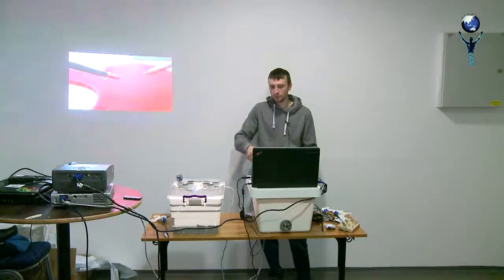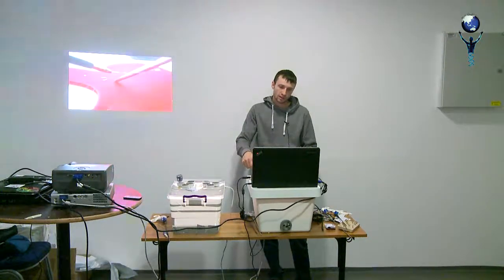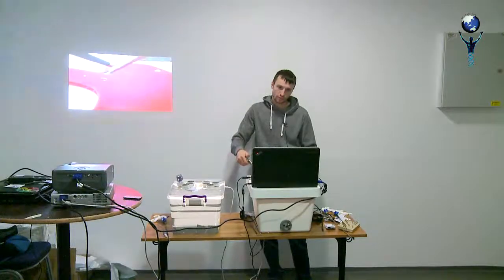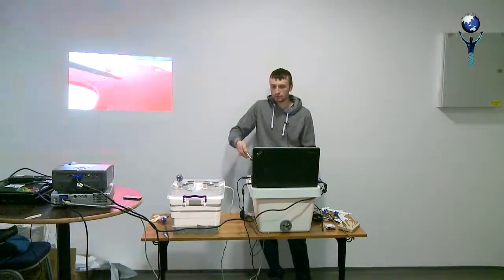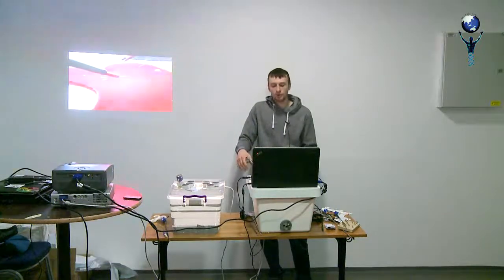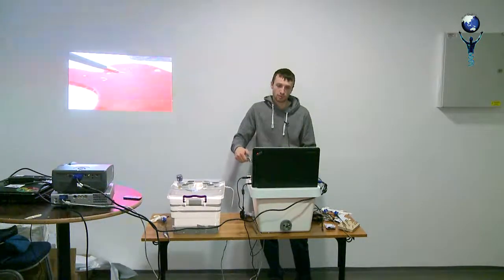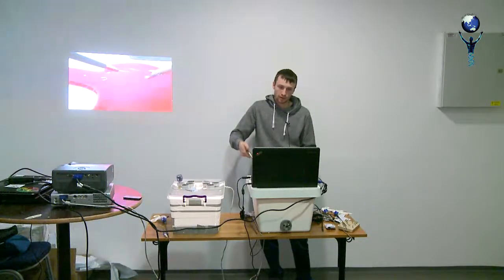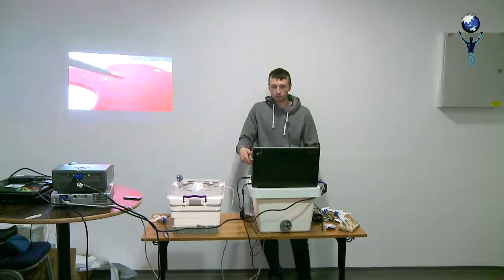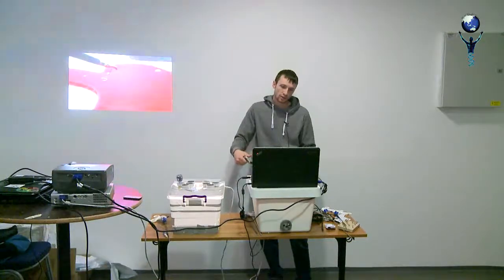There are three approaches to perform this. The first one is an elevator approach, like I told before. The right instrument is down, the left is up, and then switch. The second is only with the right hand. So you pull the wrap, and the left hand is the sleeping hand, the right hand performs a knot. Like this, over up, under up, under up, over up. And the third approach is with pronation supination. When you move the instruments, the left instrument like this, maybe it makes knot tying easier for you.